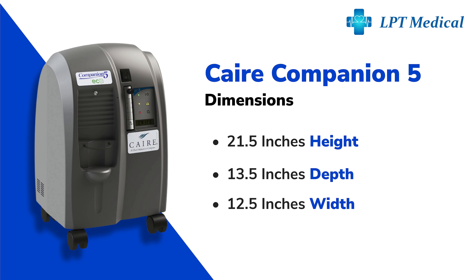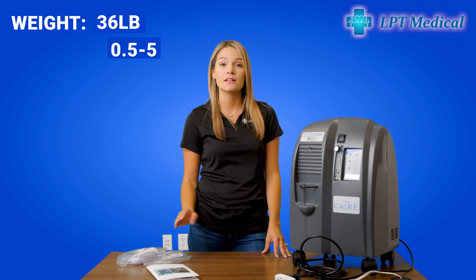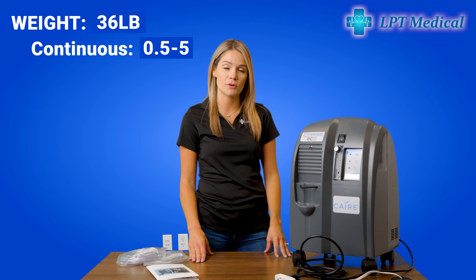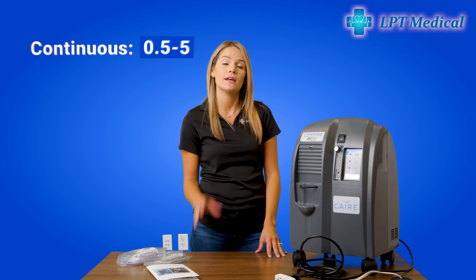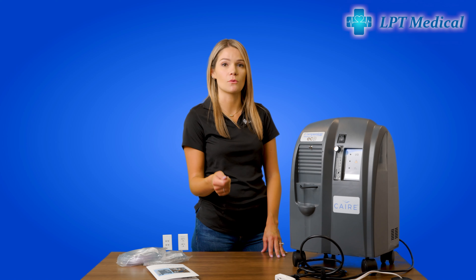The Care Companion 5 is 21 and a half inches high, 13 and a half inches in depth, and 12 and a half inches wide. It weighs 36 pounds and does 0.5 to 5 liters per minute on a continuous flow. It is a stationary oxygen concentrator, so it is meant to be plugged into the wall. It's very durable, so you can run this unit 24/7, and it is also CPAP and BiPAP compatible.